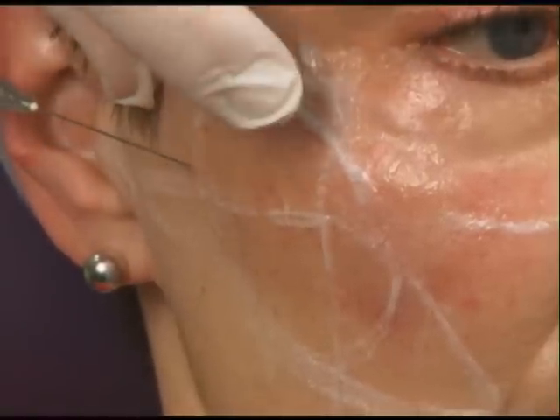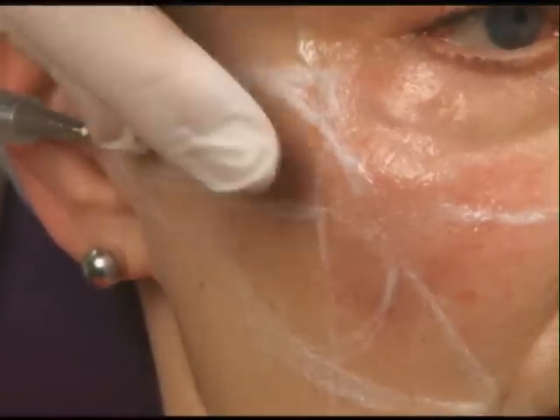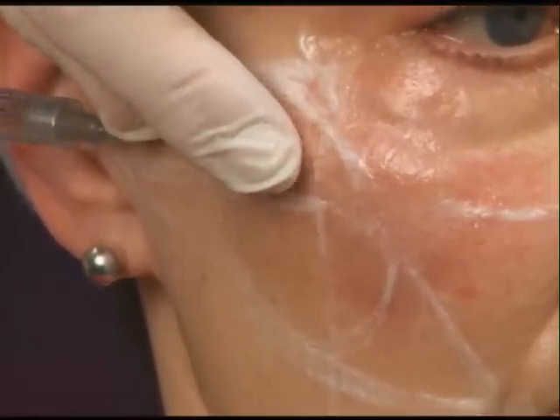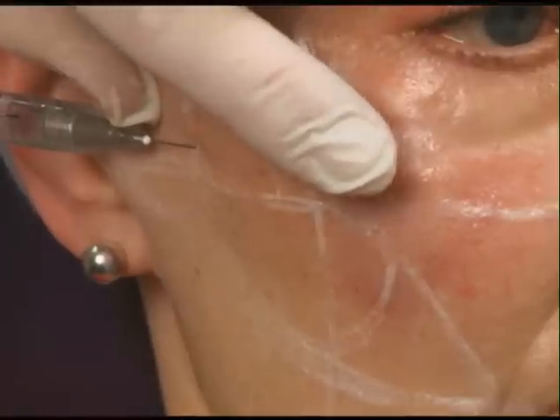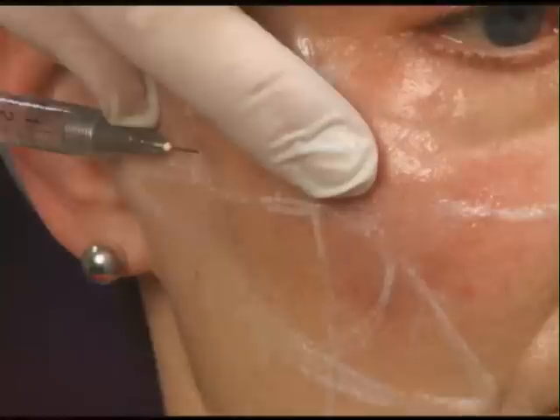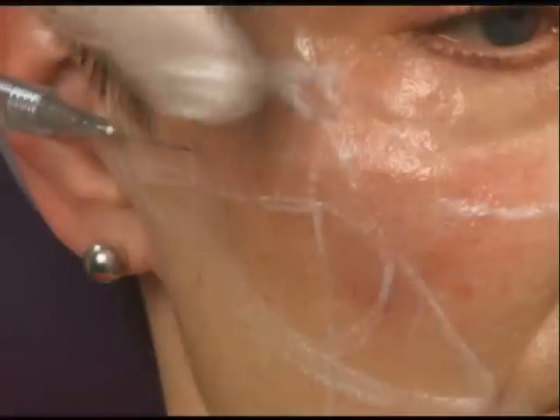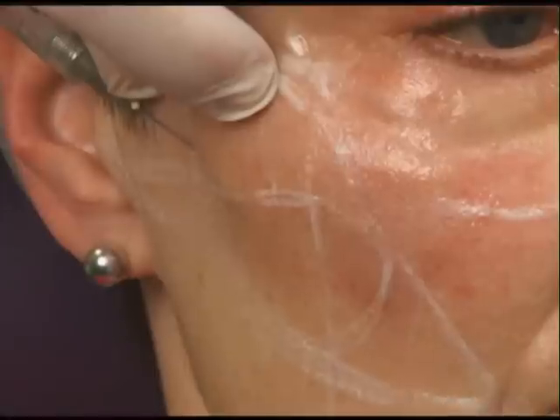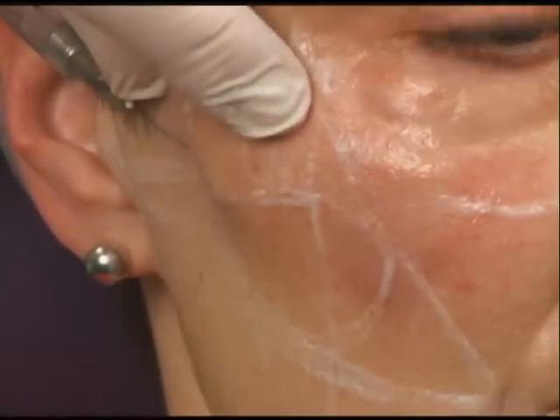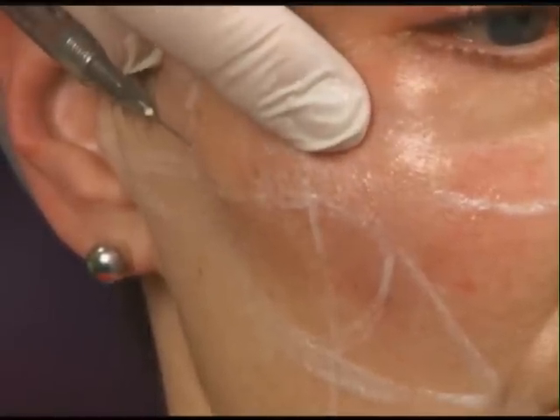Here I'm going to use a 27-gauge, one-and-a-half-inch needle. I'm just going in at the edge of my oval, like a little pinch. I'm subdermal and I'm going to inject as I advance. Out here can be a little bit fibrous, especially as we get closer to the ear. So I'm going to be subdermal but not much deeper than that — I don't want to get into the masseter muscle or the parotid gland. I'm using a 27-gauge hyaluronic acid, which is very easy to mold and very soft. It looks smoother in this area than some other fillers, and the lateral cheek is not as forgiving because of the fibrous tissue.